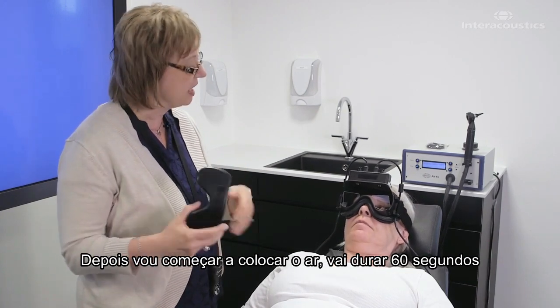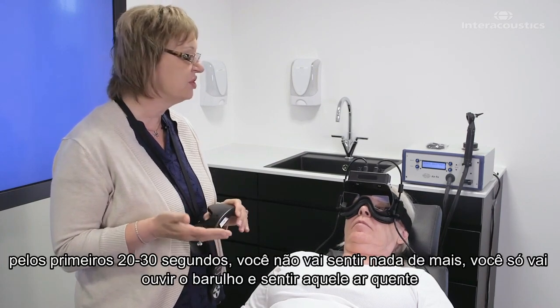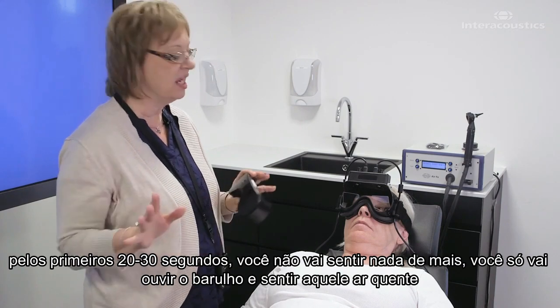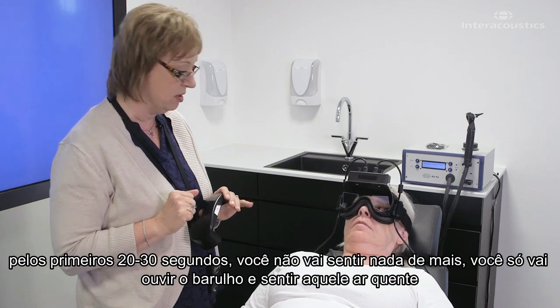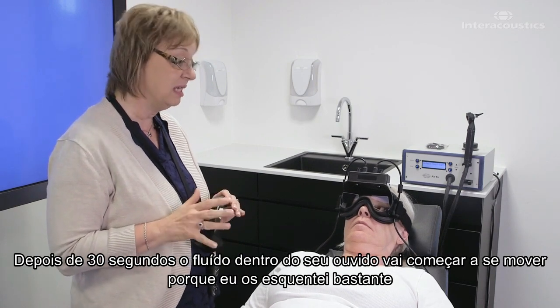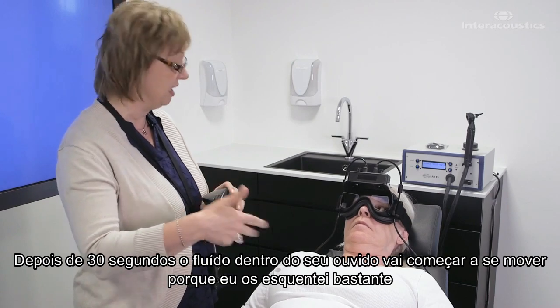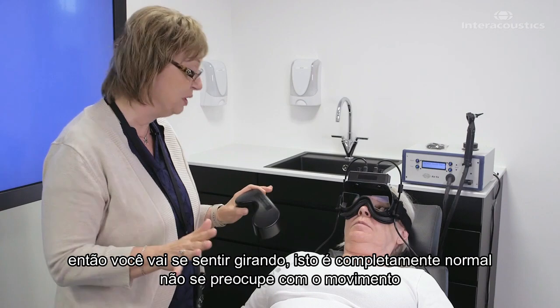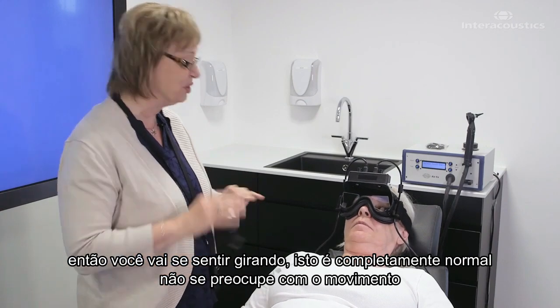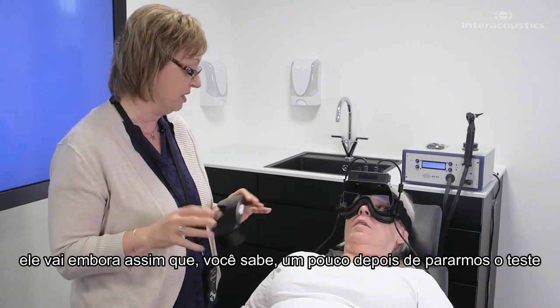I'm going to start blowing the air in there. I'm going to have this cover on the goggles and your eyes are going to be wide open. It's going to last 60 seconds. For the first 20 to 30 seconds, you're not going to feel anything at all — you're just going to hear that noise and feel that warm air. After about 30 seconds, the fluids inside of your ear are going to start to move because I've heated them up, and so you're going to start to feel like you're turning. That's completely normal — it's going to go away shortly after we stop the test.